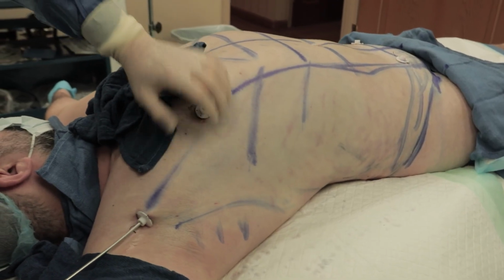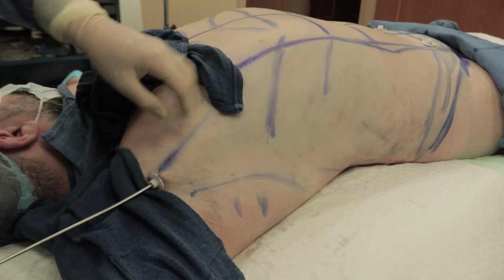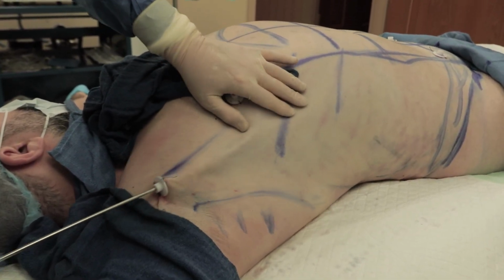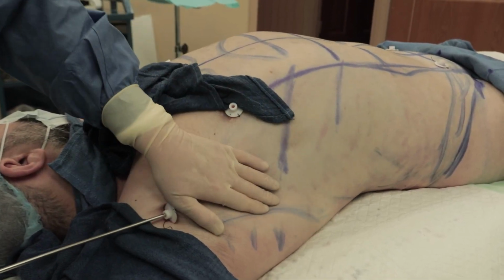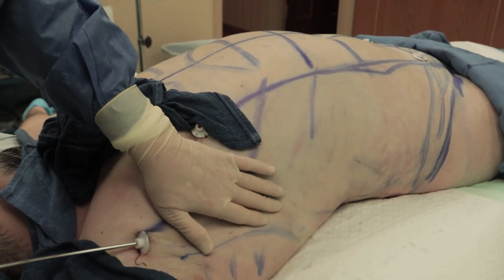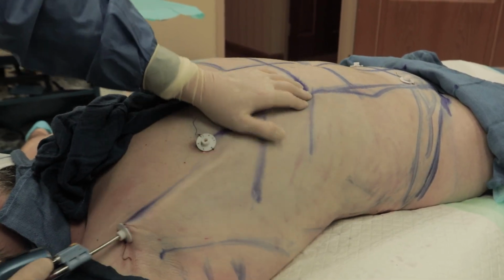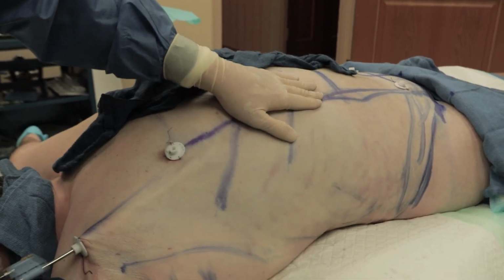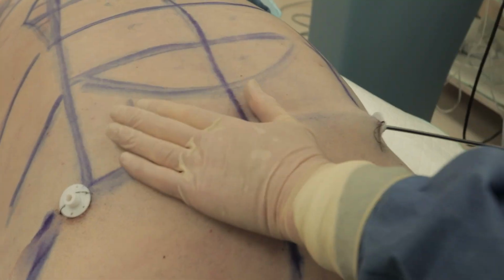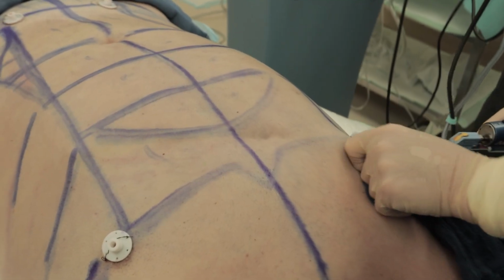So now, with my smart hand, I'm etching, grabbing the muscle. And I'm getting into this negative space. This guy's fixated on two things, mainly. The armpit and the sides of his belly to the back. And if he's fixated, so am I. Maintain that volume there.